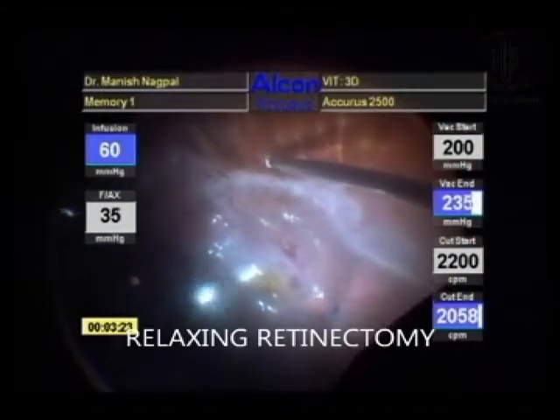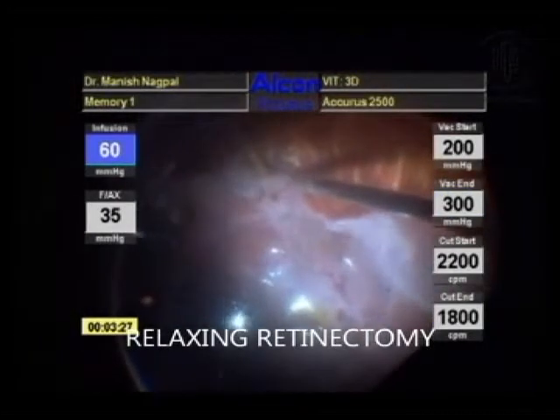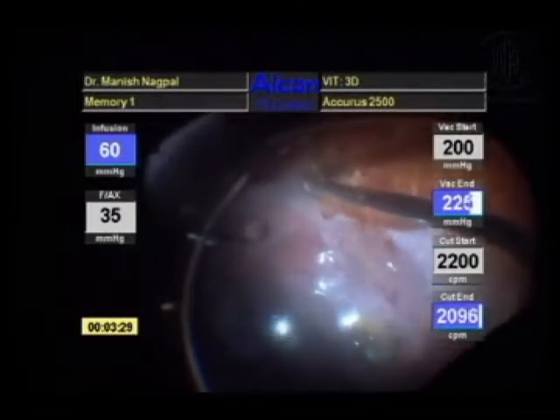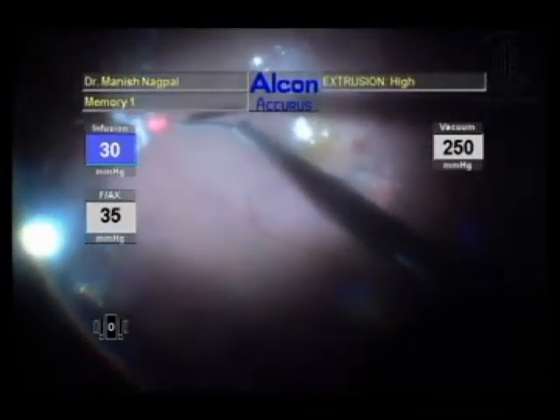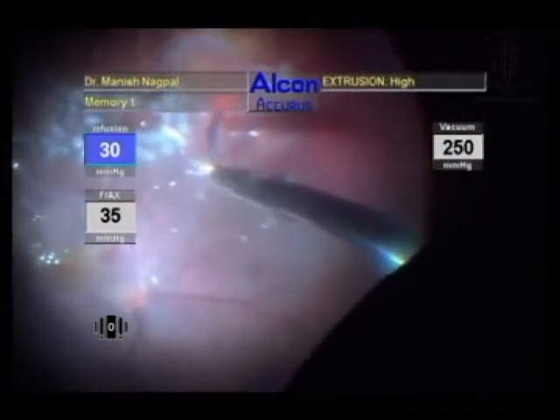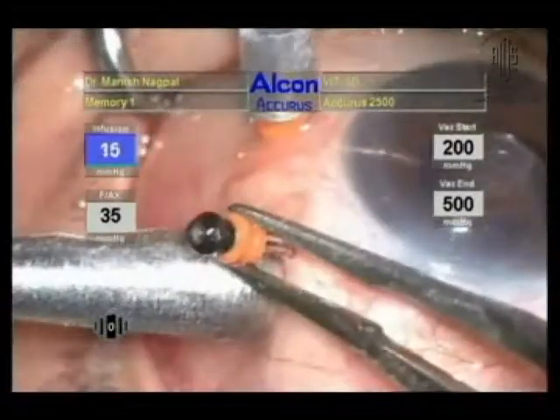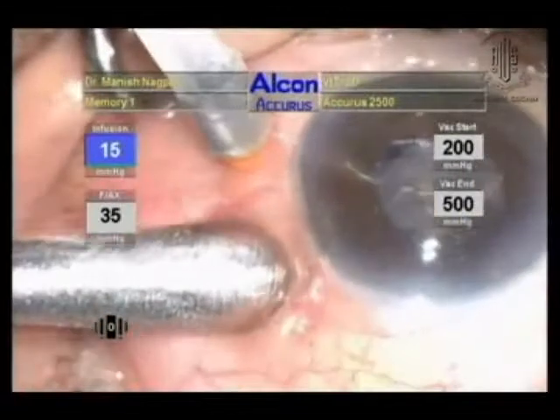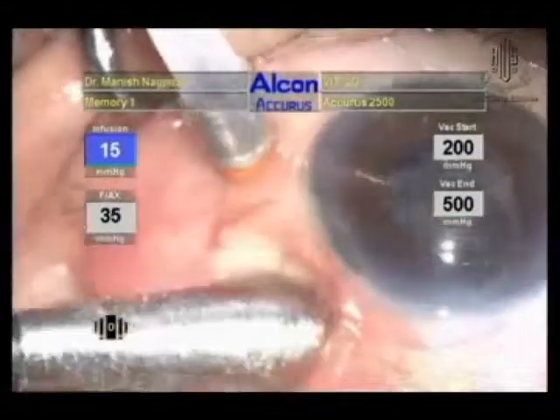Persisting traction is further released with a relaxing retinectomy. Endolaser is carried out. At the end of the procedure, the small gauge cannulas are removed with minimal trauma to the underlying conjunctiva.